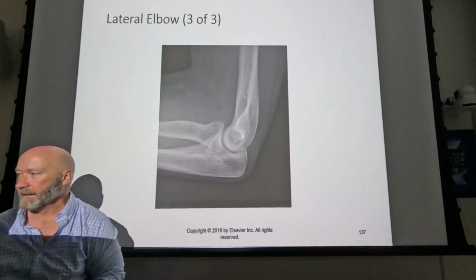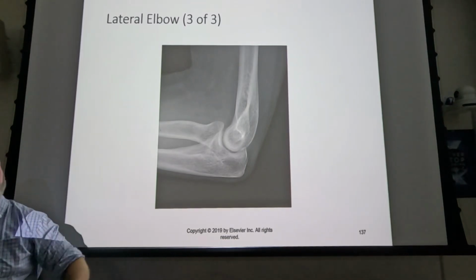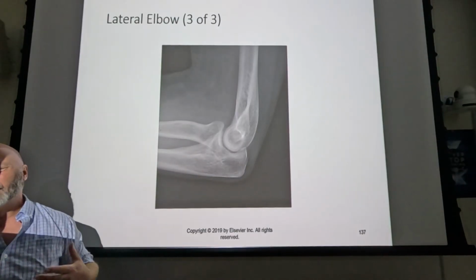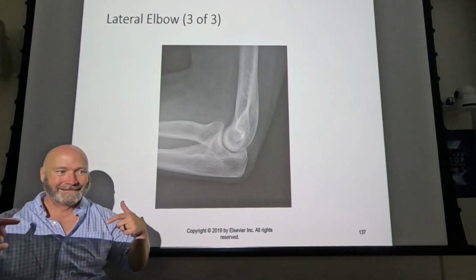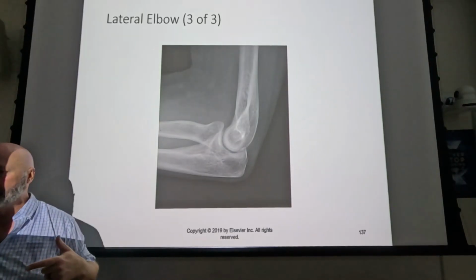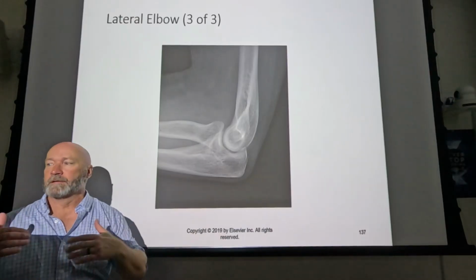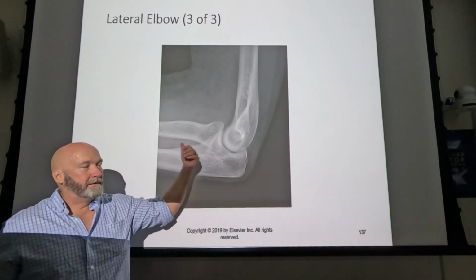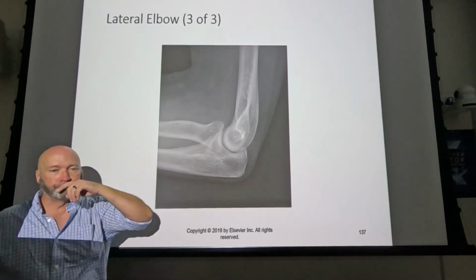Neither one is going to be ideal. Both of them are going to be kind of ugly, especially right in the elbow joint. But remember, this is your most important view. So you maybe see the fracture on the partial flexion AP. That's two partial flexion APs. Every time you do that, it's going to be two. And then possibly see your fracture on the lateral.